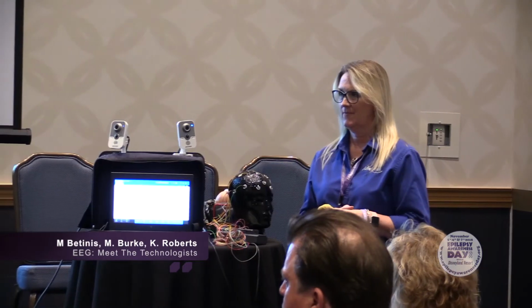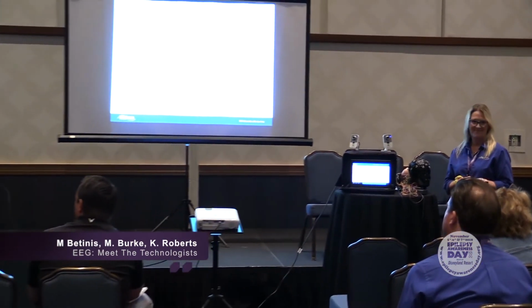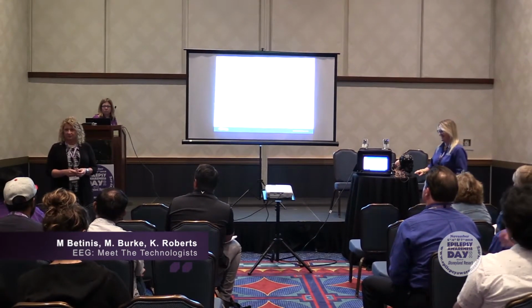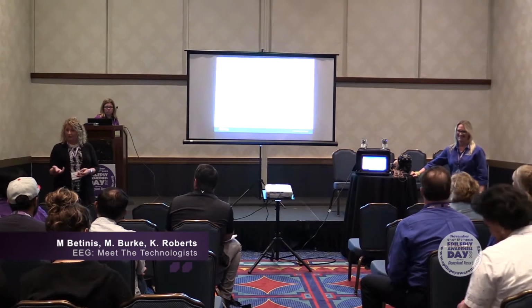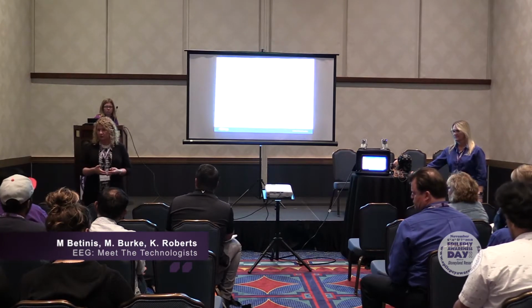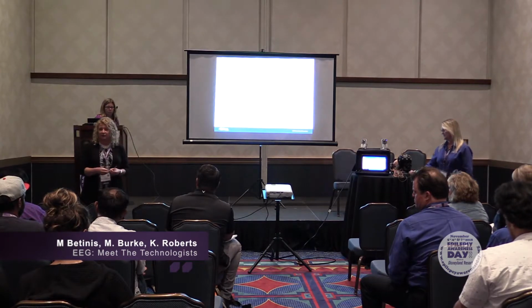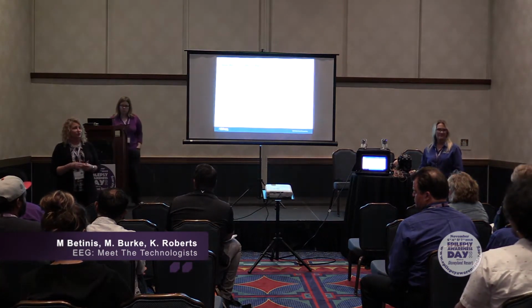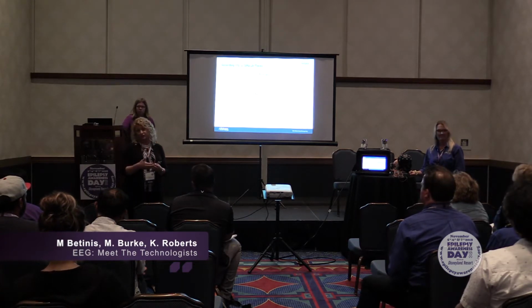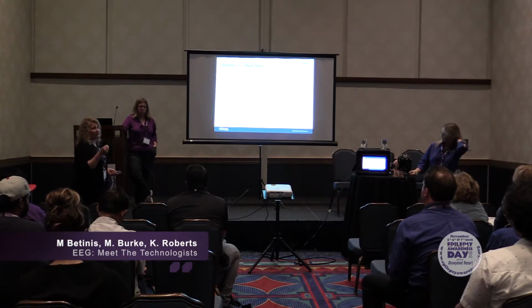No. So basically, our job is to acquire as much information as possible, and we know, right? As trained, skilled technologists, we should know whether something is credible or not, and continue to say, maybe you want to capture a few more, as time allows, right? The role of a technologist is that we can capture information and describe what we see, but we cannot give an interpretation. That is from the physician. So hence the reason why it's so important that you have a well-trained technologist doing this study.